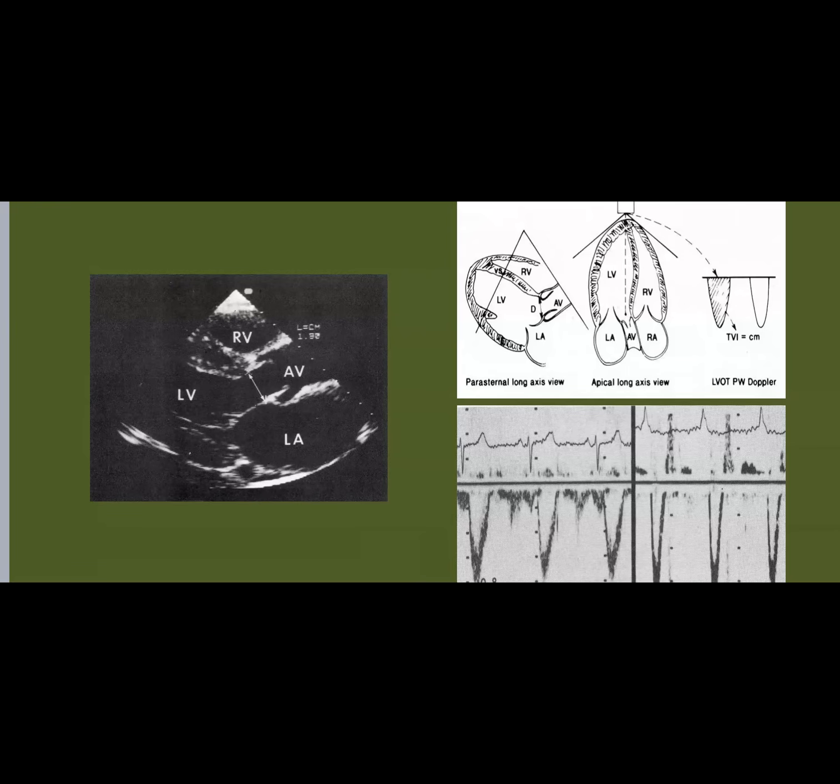Does that make sense? Yes. If we have low flow volume, we are going to overestimate the ejection fraction. So this is the problem.